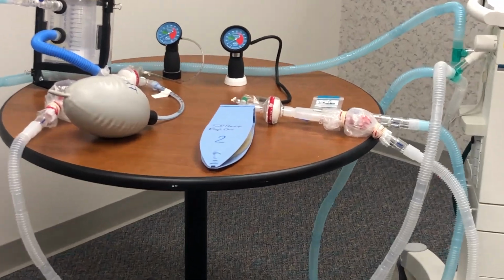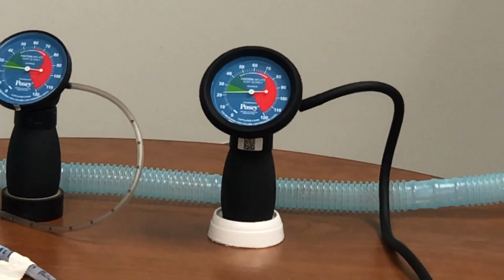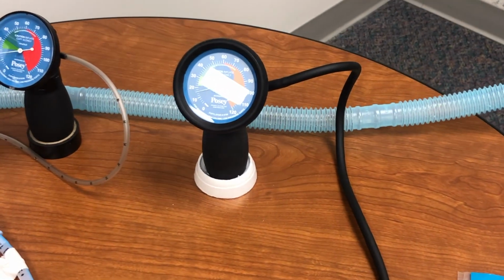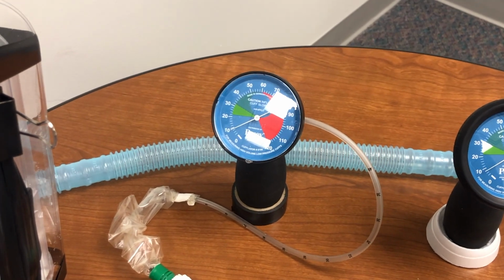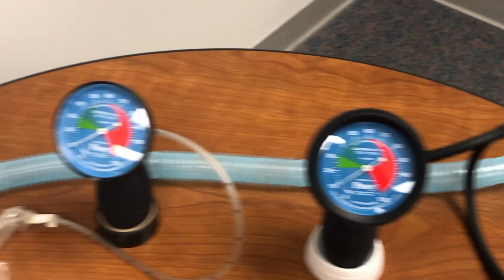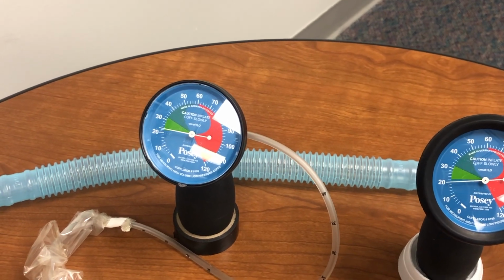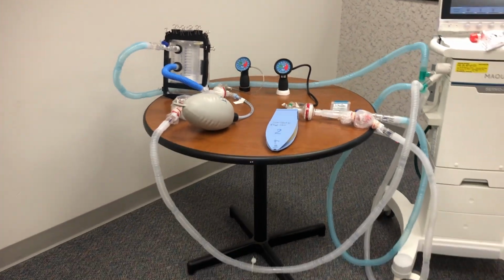That is again very important, because if you see, I can see the PEEP here, which is around 8, which is the PEEP of the ventilator. And this one is also, if you see, the PEEP comes to around 8 again, and the peak pressure here is 20, and in this patient the peak pressure is around 22. Yep, 22 to 24. So this completes the setup.